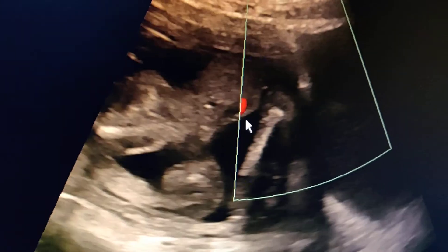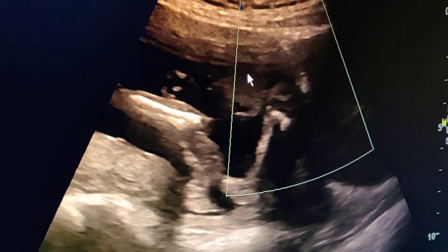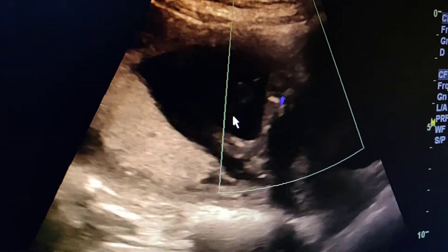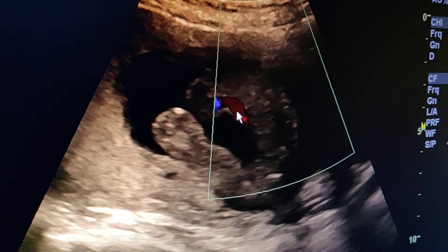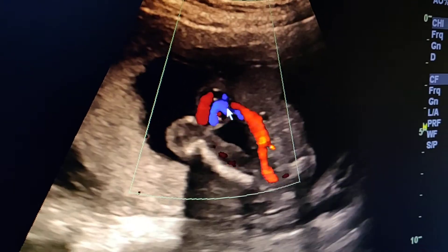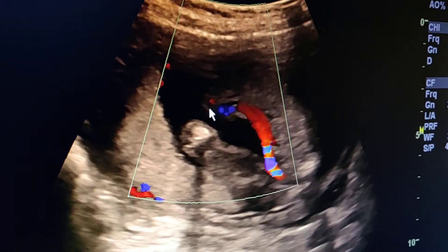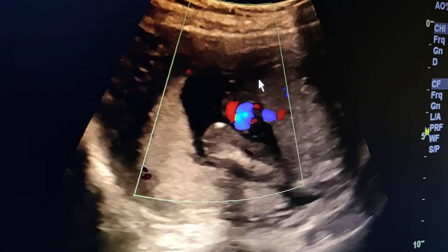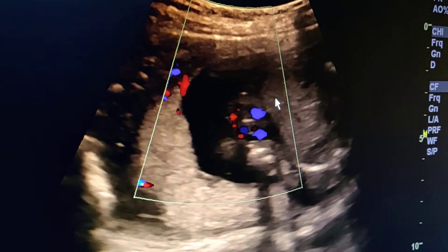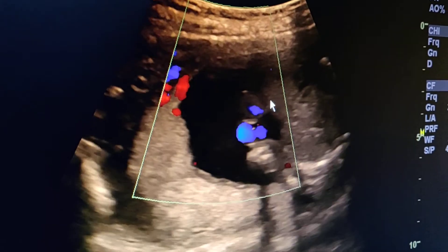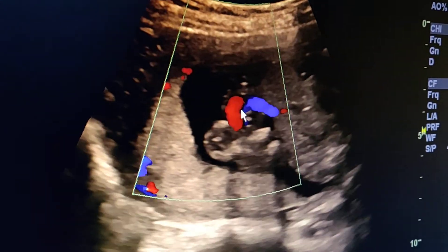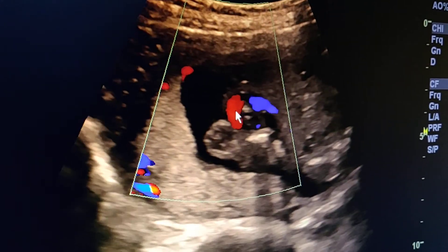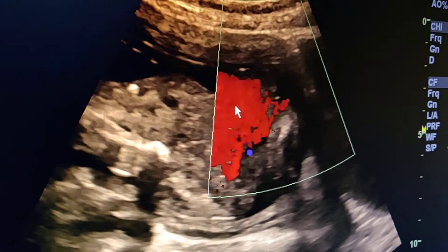This is the cord and this is the omphalocele over here. Let us try to see it in the transverse section — you can see the omphalocele going on. This is the cord going from here, and besides the cord you can see there is an outpatching in which the abdominal contents have herniated through the opening of the umbilical cord and the anterior abdominal wall. This is nothing but the omphalocele.